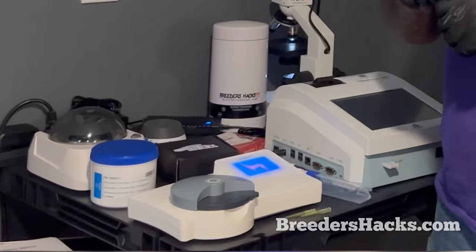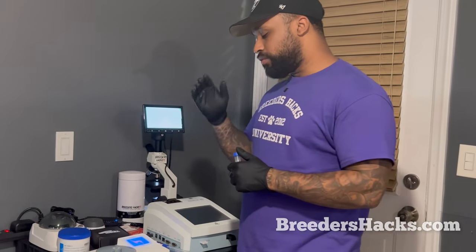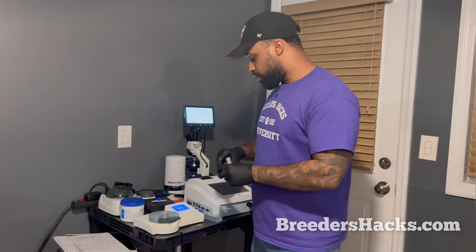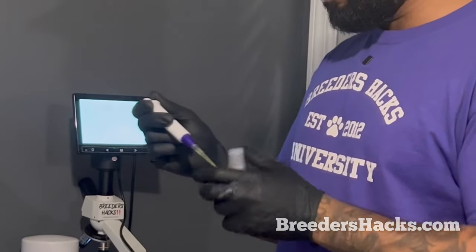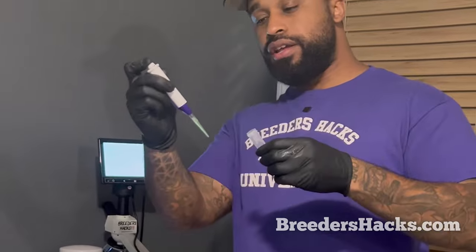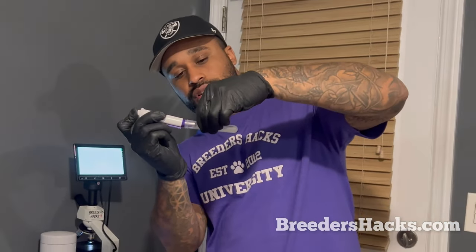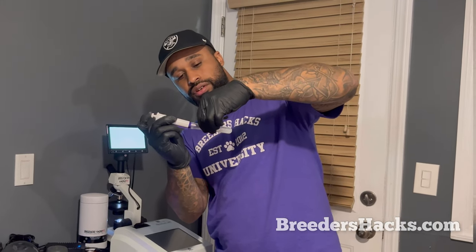The photometer does all that work for you. I have videos, if you ever buy a microscope from us, you get those videos for free and stuff like that. But anyway, guys, we have our microscope, we have our photometer. I'm gonna take our semen now, and we're going to take a pipette. I'm just gonna use my progesterone machine pipette. This should be fine. And we're gonna go ahead and draw out as much, you really don't need much actually, to be honest.